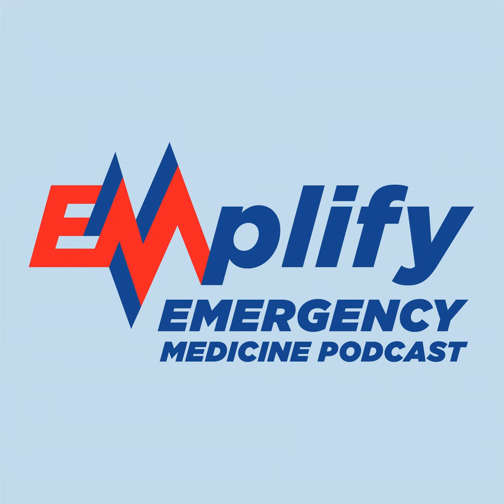Yeah, I think that's good insight. So hyperoxia in many scenarios is bad for patients, just like hypoxia is. It's kind of like Goldilocks: you don't want too much, you don't want too little, you want just right. And I think it's totally reasonable to start at 100%, especially if you had a difficult intubation, because they may desaturate once placed on the ventilator, and you don't really know what their oxygen requirements are going to be. But if you choose to do 100%, I would sit at the bedside and then decrease the FiO2 until you have a saturation on your pulse oximeter that is acceptable for the range based on the patient's clinical status.